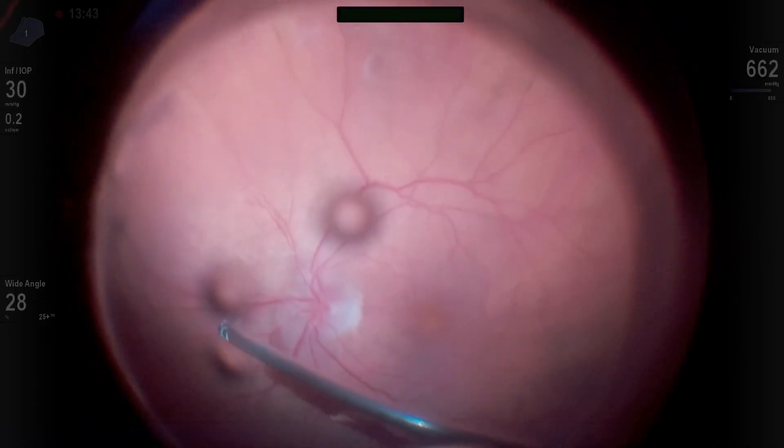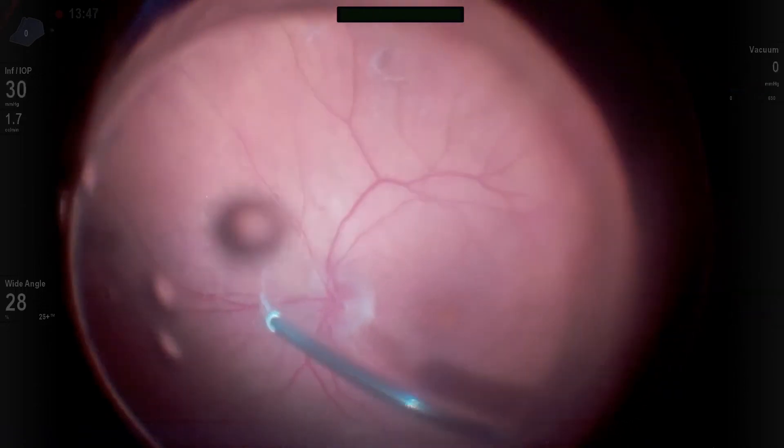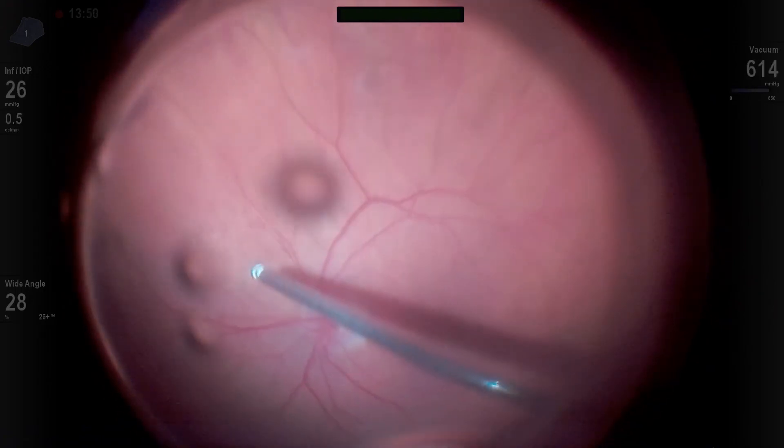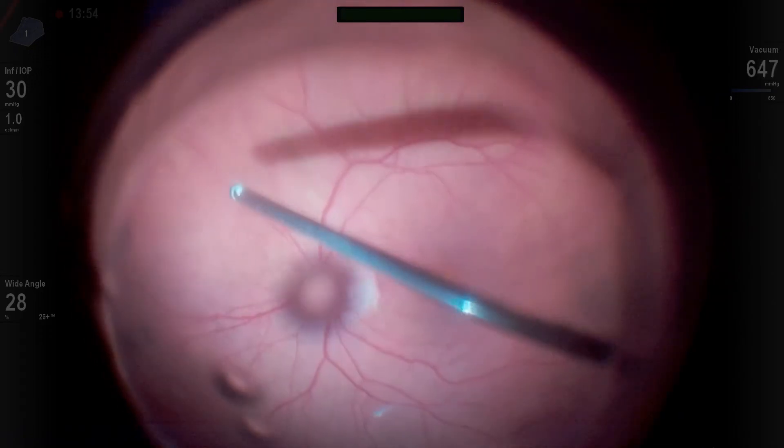We saw a little bit of vitreous stuck down on the nasal aspect of the nerve. Recognize that — it's a good time to put in some extra intravitreal triamcinolone to identify that vitreous and make sure you've peeled it all out.